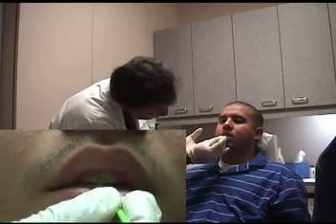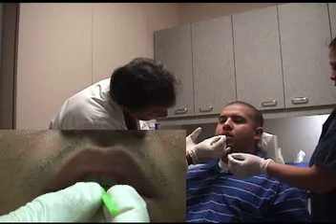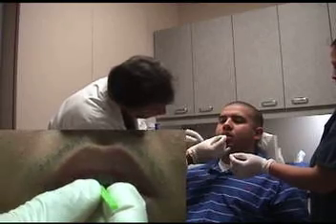And go ahead and just close on that. Okay. Maybe open just the tiniest little bit. A little bit. There you go. Just hold that position for me.